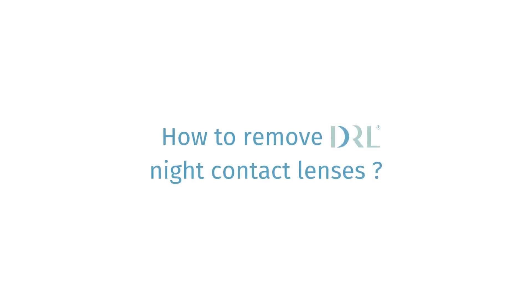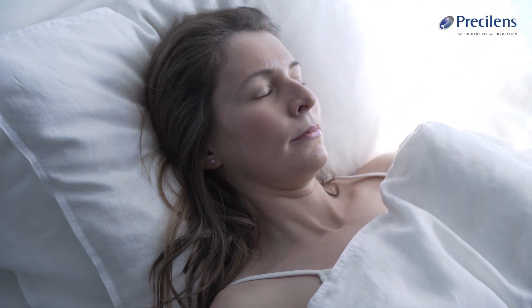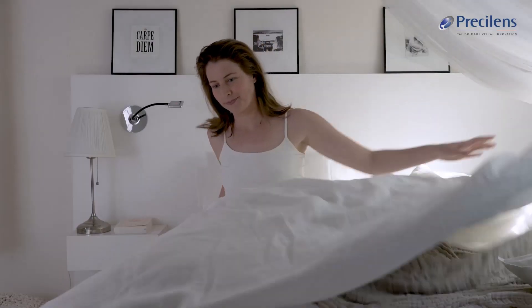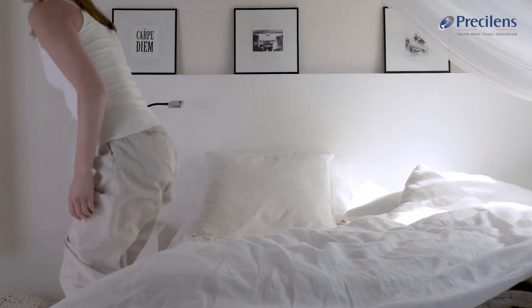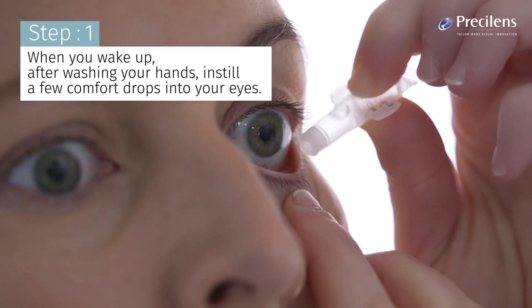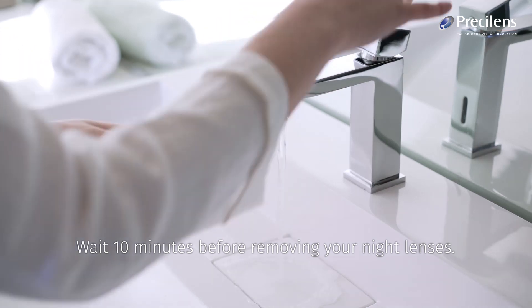Removing your night lenses is quick and easy. When you wake up, after washing your hands, instill a few comfort drops into your eyes. Wait 10 minutes before removing your night lenses.